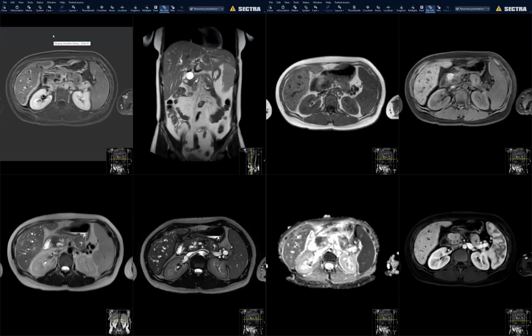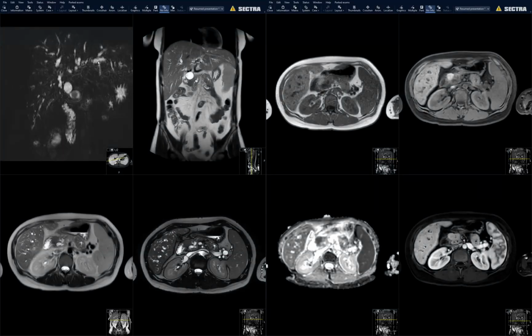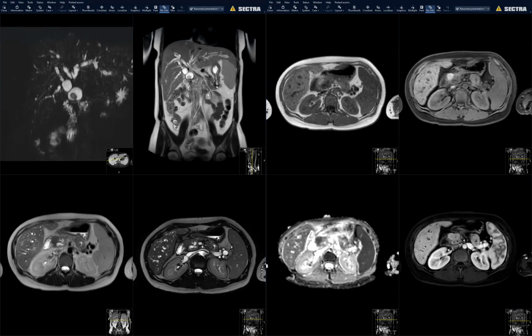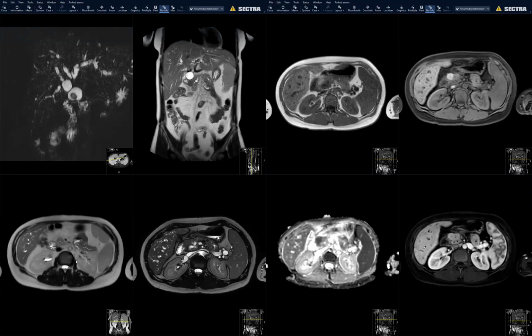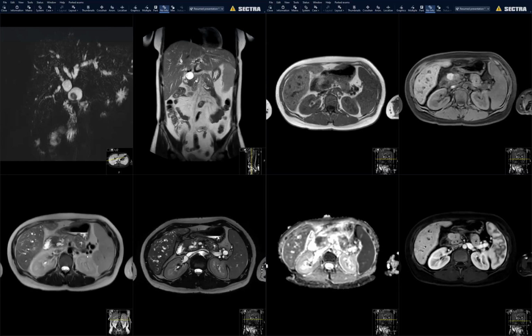The fact that it's T1 bright and potentially doesn't enhance makes you think it's a hemorrhagic or proteinaceous filled space. Is that something that can cause this obstruction, or are these two totally different things? Well, pseudocysts can be under enough pressure to block ducts. Any fluid collection under enough pressure could block a duct, I guess. Does she have normal anatomy? Does she have any variant drainage?